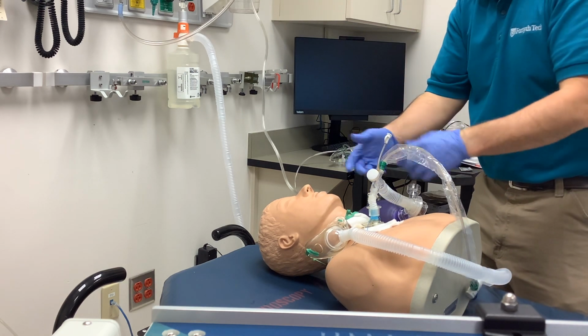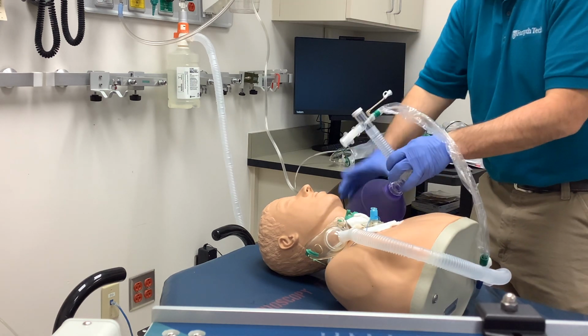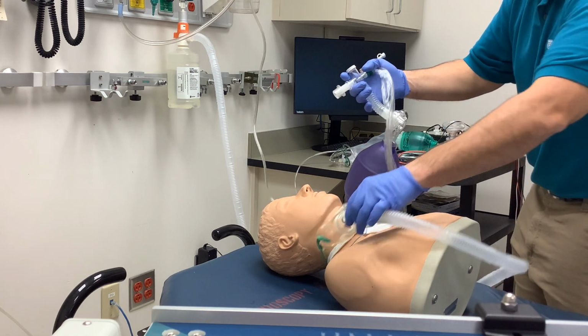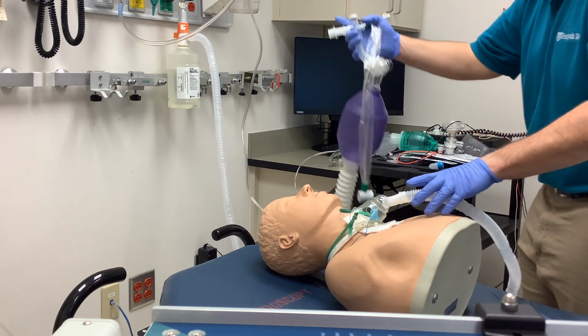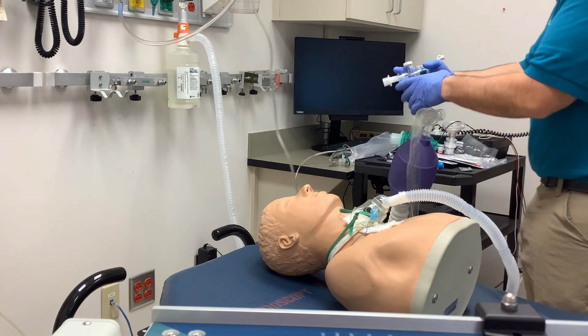And again, if a second pass is warranted, but then you can take this off. You could give a couple 100% oxygen breaths before you take that off to hyperoxygenate, return your patient back to their tracheostomy collar of 35%, wherever you've got them on, assess their breath sounds, make sure that they're good to go.